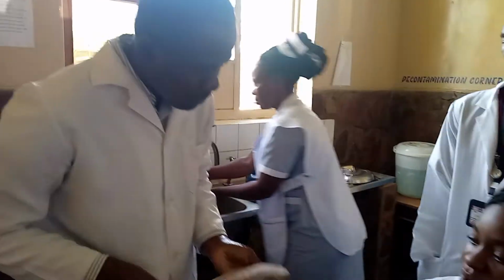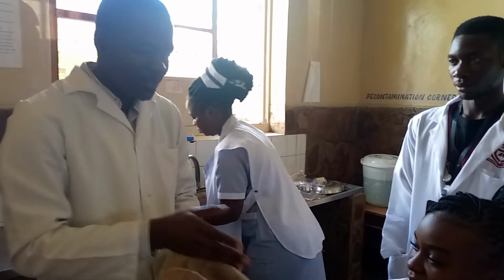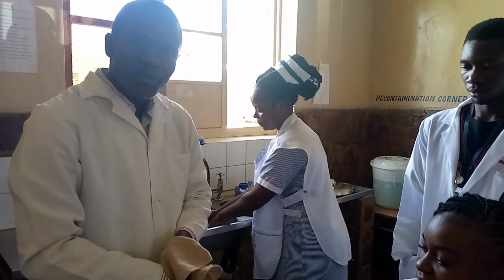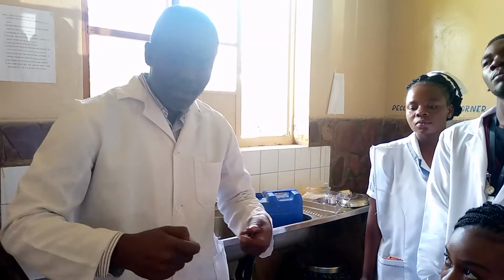Good morning, Lydia. Let me say I am a student. In this case, I'm simulating. I'm student number 2 from Rusangi University. I've been assigned to take a rapid diagnostic test on you. May I please go ahead? Is there anything I can do for you before I begin? This is more like an OPD setup, so you have to just do it. There's nothing like a bed and all that.